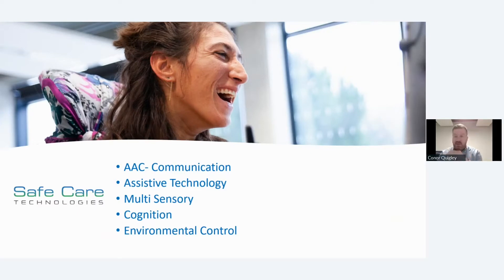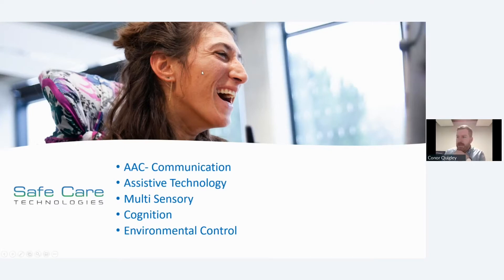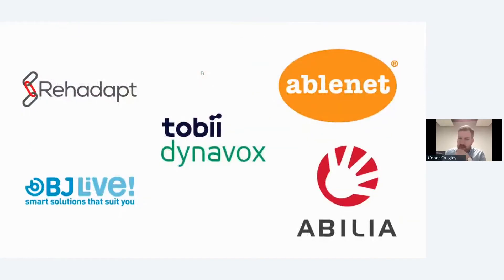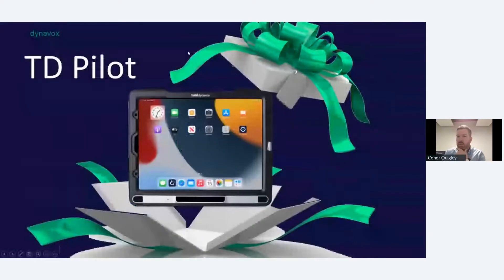Generally, if there are technology products out there that may help people with disabilities, we tend to have a look at it and try to get involved as much as we can. Some of the partners we work with are Rehadapt for mounting solutions, AbleNet, Abilia, BJLive, and Tobii Dynavox — which is the company we're going to focus on today. Their product, the TD Pilot, is a brand new device that was only launched just before Christmas.